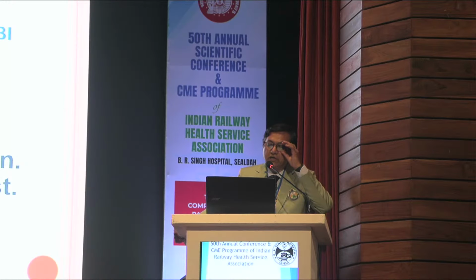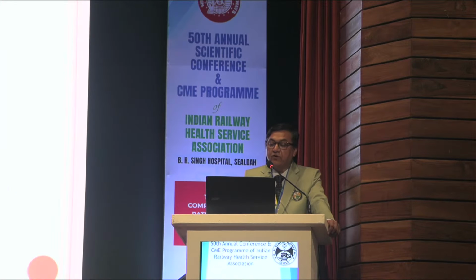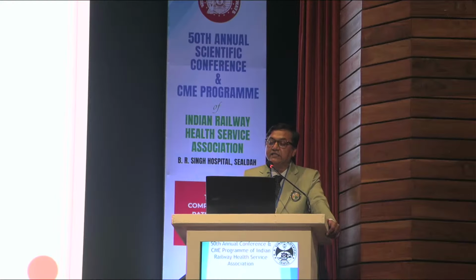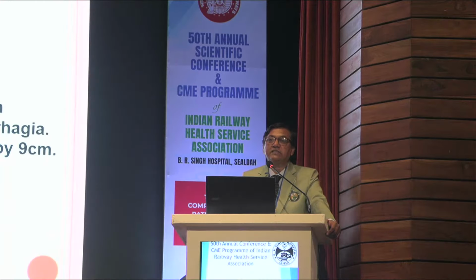An 18-year-old girl came with a history of pain in the lower abdomen, USG showed a left ovarian cyst. So left ovarian cystectomy was planned. You can see from the slide, it was done very long ago, maybe say 20 years back. We found a bicornuate uterus with a dermoid cyst. This is the hair coming out. This is being put inside a bag before retrieval. The outcome was excellent, and we were fascinated.